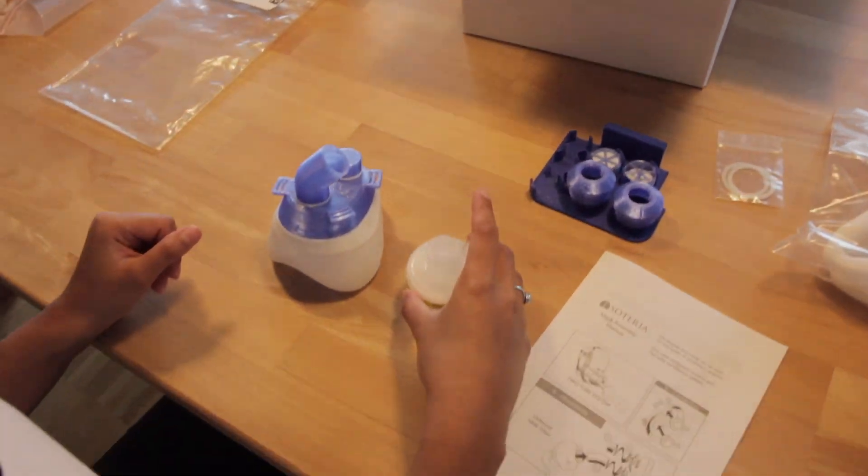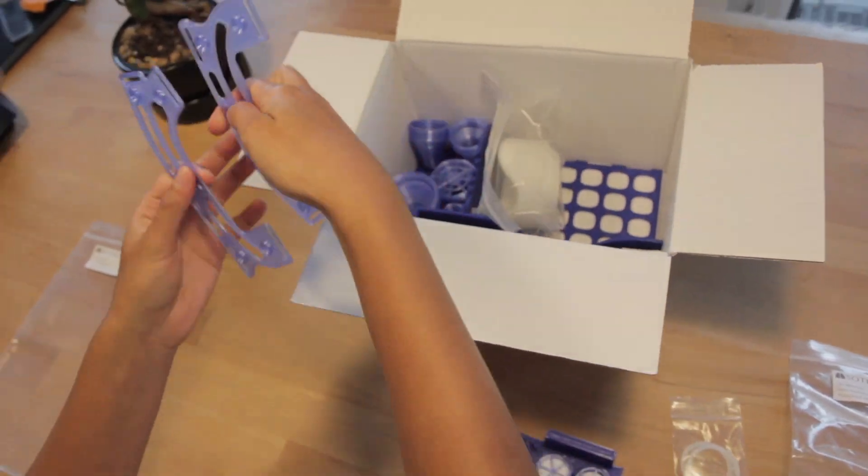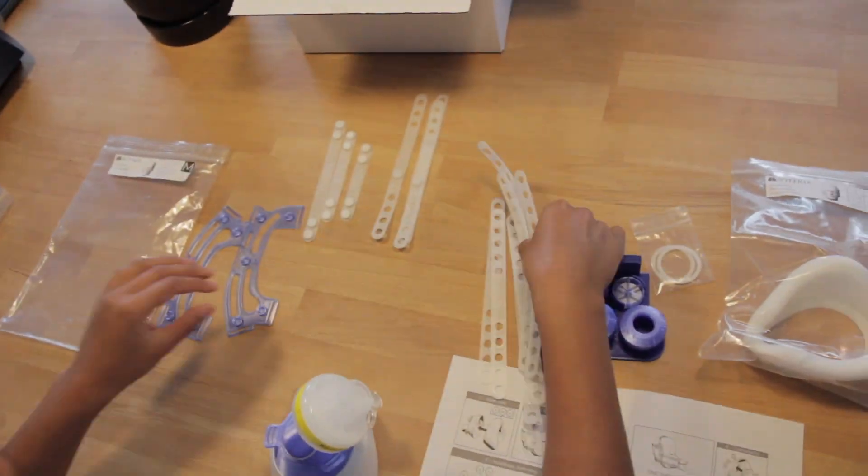Take a heat and moisture exchanger and connect it to the joining element. Then take the two head mount pieces and all the straps and sort them on the table in front of you.